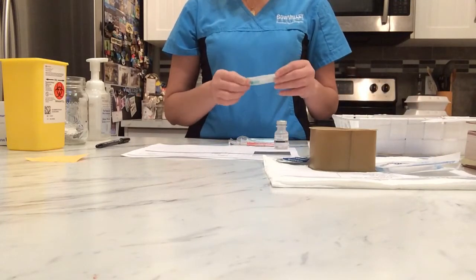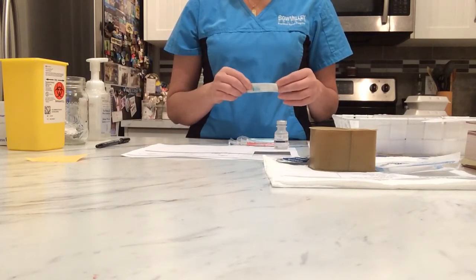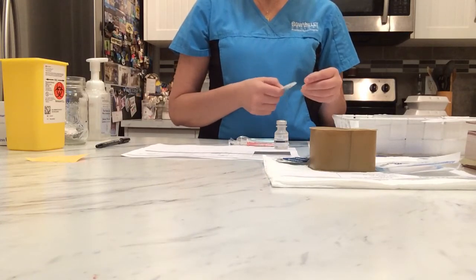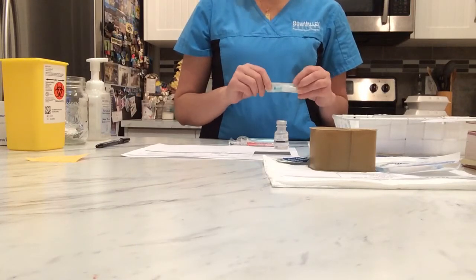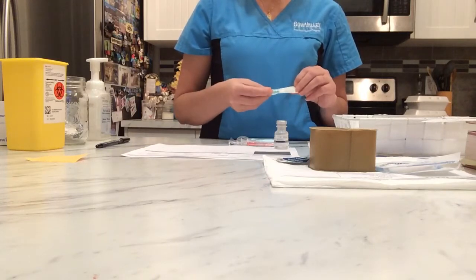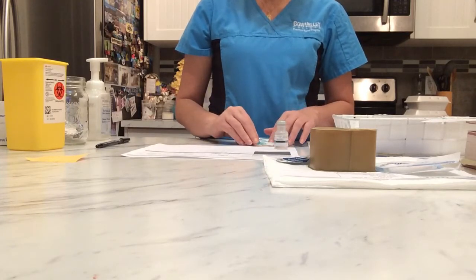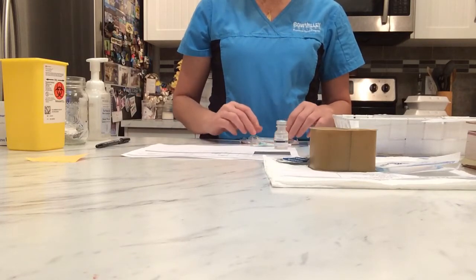Since intramuscular injection needles range between 18 to 27 gauge, I'm gonna choose the 23 gauge and 1 inch needle, since I will use the deltoid muscle for my patient, and since it's only 1 mL, I could use that muscle. If it were more, I would use the ventrogluteal muscle.